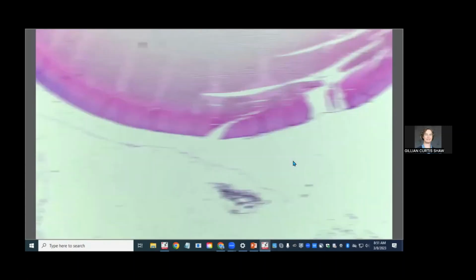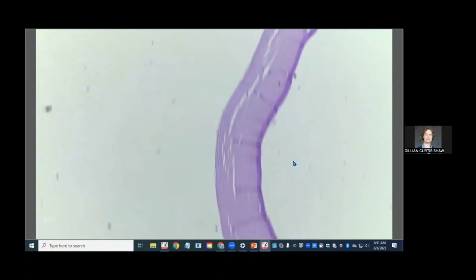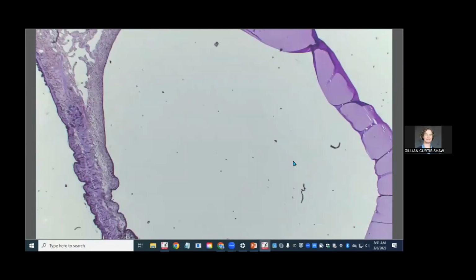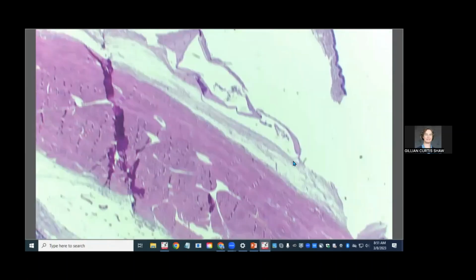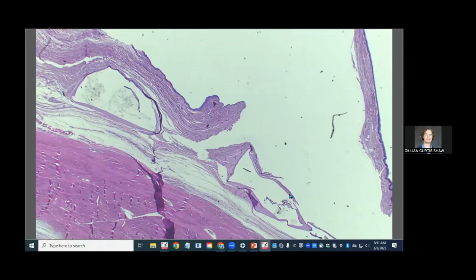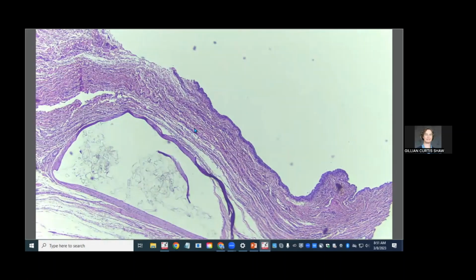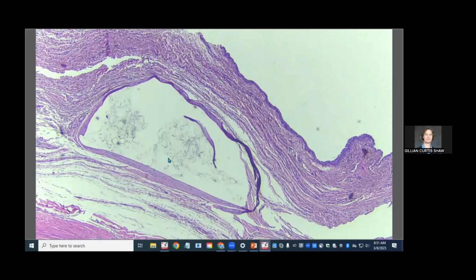The corneal changes are so mild that I'm not going to show them. There's a little bit of disorganization of the stromal collagen fibers. Over here in the right eye, though, I wanted to briefly show you just because it's kind of cool. Back to where we had on the gross those cyclosporin implants, here they are histologically. There are these very sharply delineated spaces in the episcleral or subconjunctival connective tissue, and there's a little bit of fibrosis around these. Inside, a little bit folded up and funkily sampled, there's this poorly staining material.